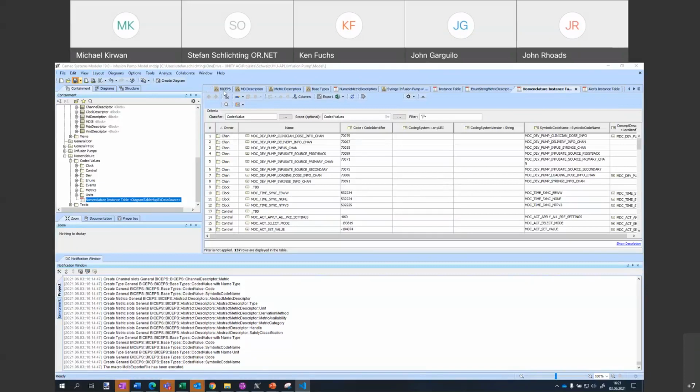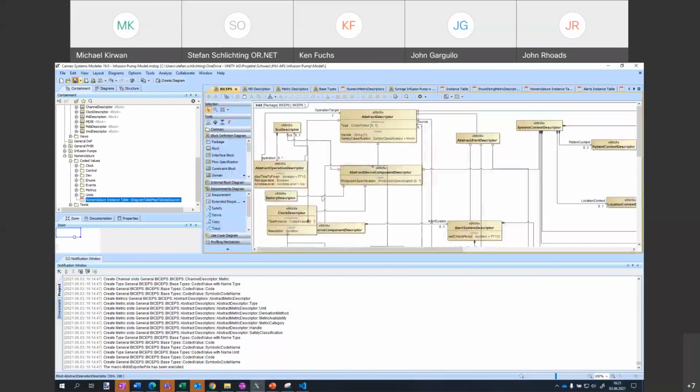Yeah, of course, I did some tweaks to the representation so that I can easily, for example, include the nomenclature. I changed some things which you could have modeled differently, so that it makes the usage with this external nomenclature easy. But of course, it's still a representation of the whole device and of the whole BICEPS model. And just if it's a filled diamond or an open diamond, that is sometimes a point of discussion, and I changed it so that it works nicely in the tool, so that I don't have to mess around with that.